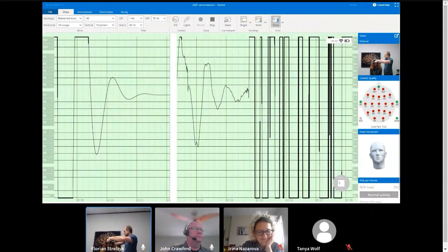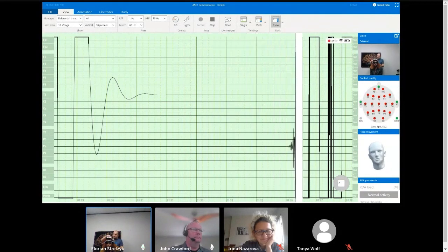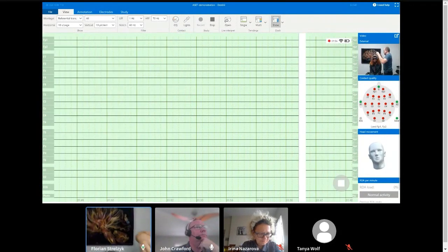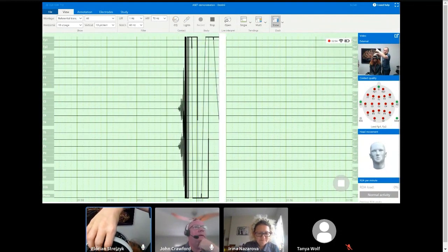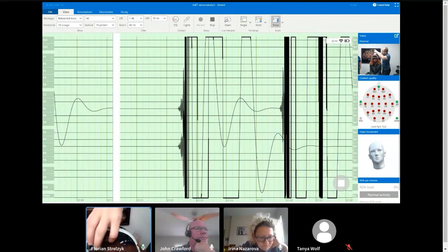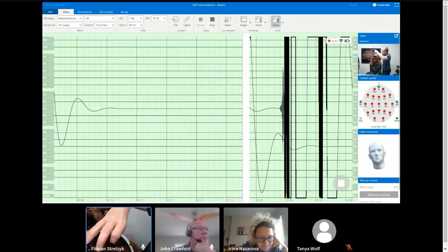Okay. So now I'm starting to engage the headbands. And you can't really see it that well. I'll move the camera closer right now. Do you see this a little bit better, what I'm doing? Yes, we see. What I'm doing now is adjusting the headband, and I'm literally just wobbling the electrode to get through to the scalp.